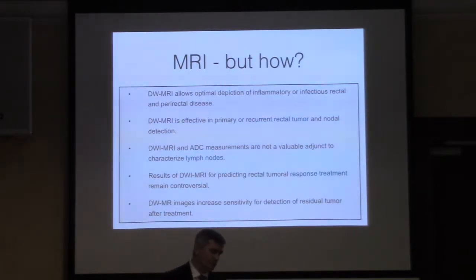Now the problem with treatment response is that rectal cancers are a very heterogeneous group of tumours, and they respond in very different ways to chemoradiotherapy. So some will show significant signal changes, which you can see, both on T2 and on DWI, and others won't, but have responded. So because of that non-linear response to therapy, you can't reliably use DWI to predict response. It's part of the picture, but it isn't an absolute yes-no.